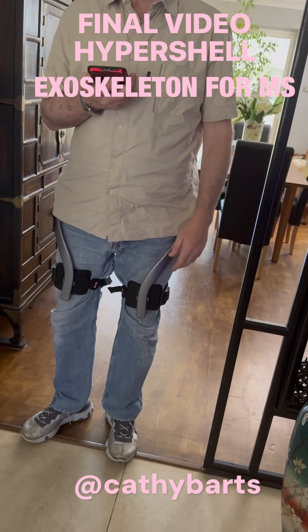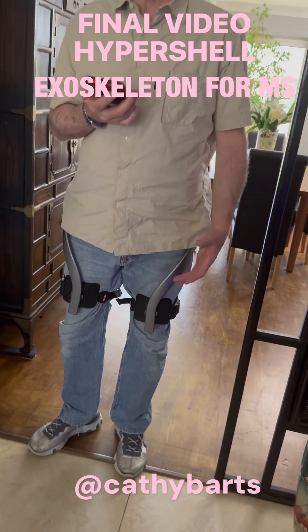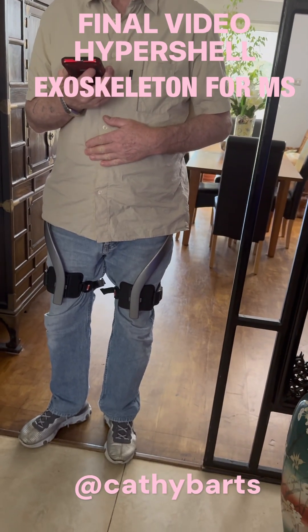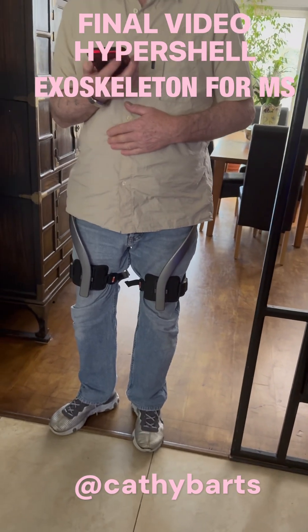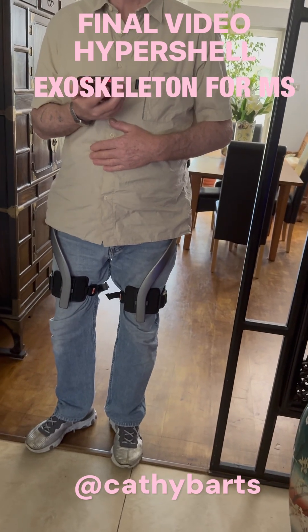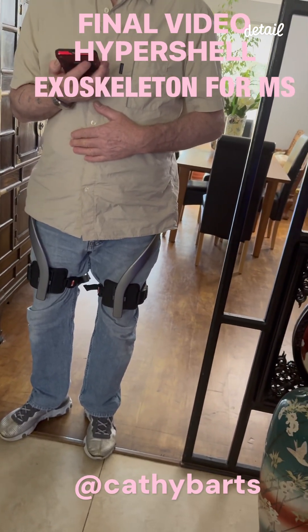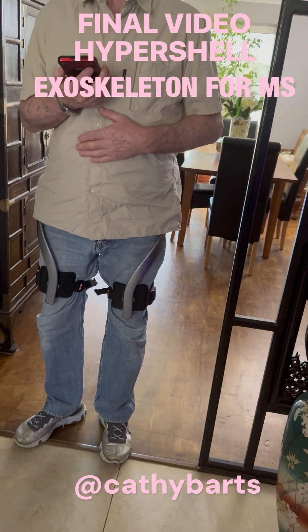I'm sort of lost for words because I don't want to get people's hopes up, but I am not the only one by a long shot. A lot of people with multiple sclerosis have come forward and said they are using them via the disabled chat apps that my wife is involved in. It is a financial burden — I can't afford it, it's not just a win.